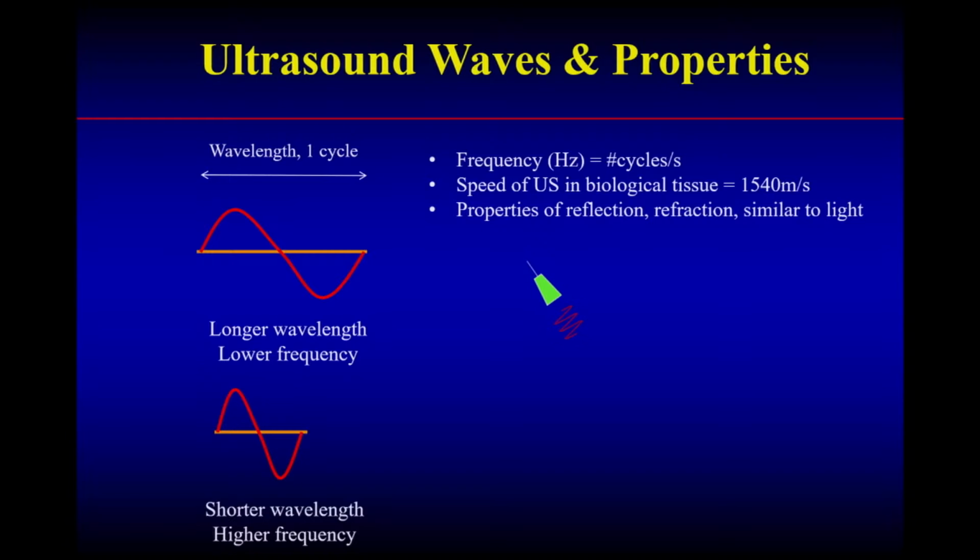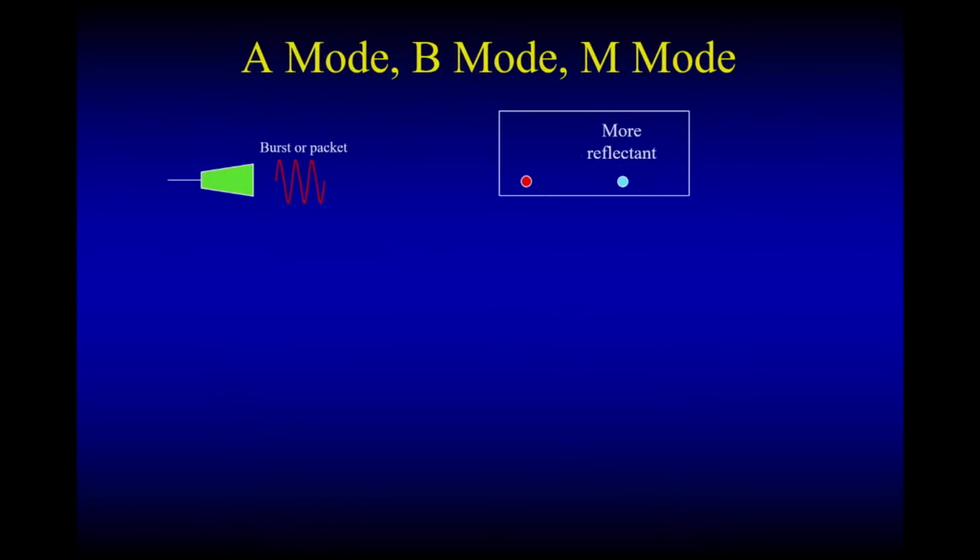So if we take the transducer, we send usually small packets of ultrasound, and they are in the ultra range, so we cannot hear them because they're in the megahertz range. If they reflect off a surface, whatever that surface is, some of it is refracted, and we're not going to see that. Some of it is reflected in a symmetrical fashion, and we don't see that because it's not captured by the transducer. So what you see is that little tiny fraction that comes back perpendicular in the same direction that you sent it out, and the image is processed. So that's how the images are processed.